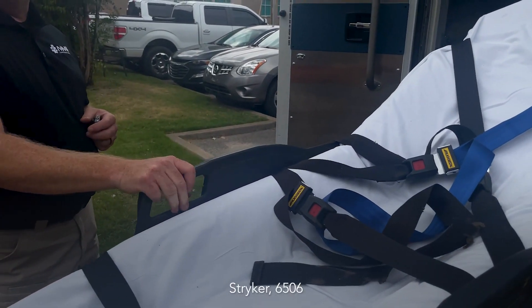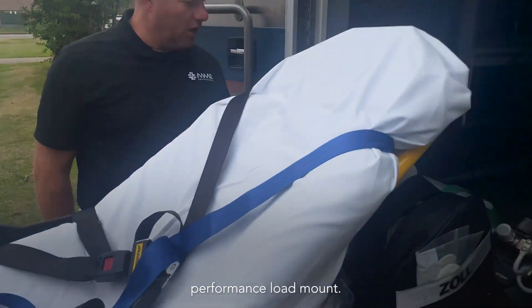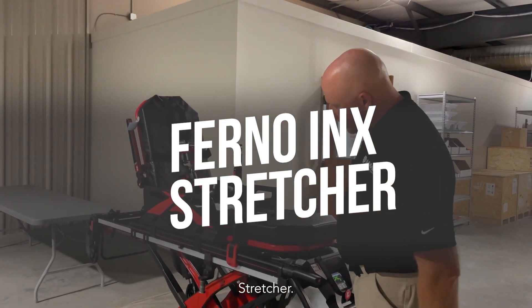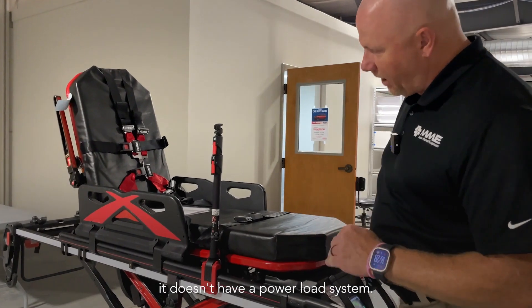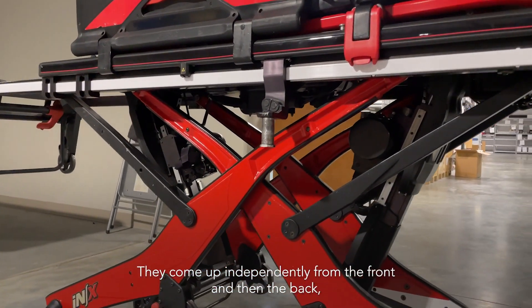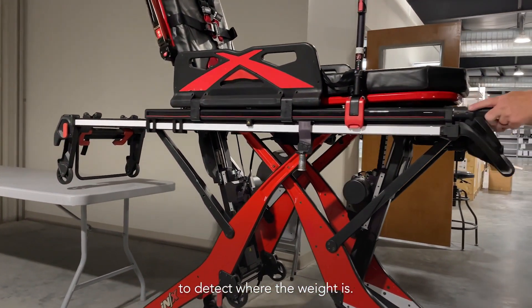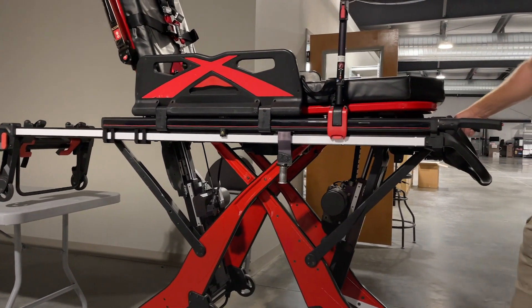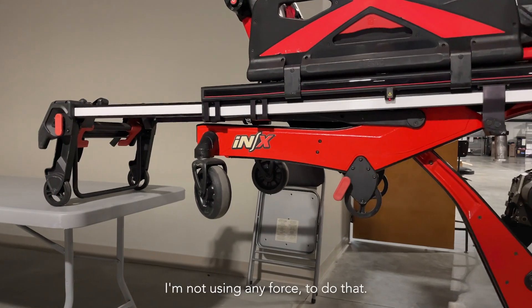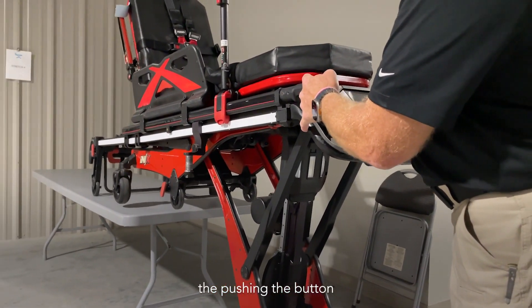This is the Ferno INX stretcher. The INX is a pretty unique stretcher — it doesn't have a power load system. The legs come up independently, first from the front and then the back, and it has multiple sensors along the way to detect where the weight is. We will simulate loading this into the back of an ambulance. Right now I'm not using any force other than pushing the button.